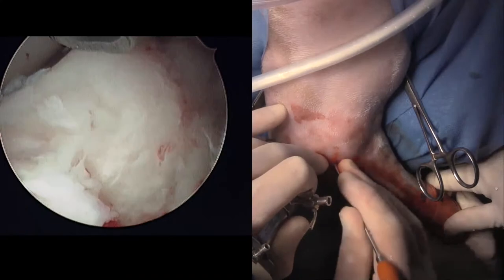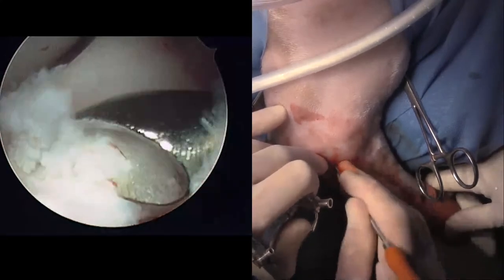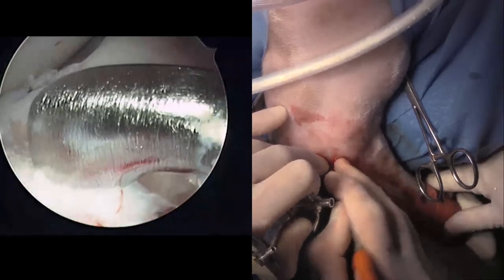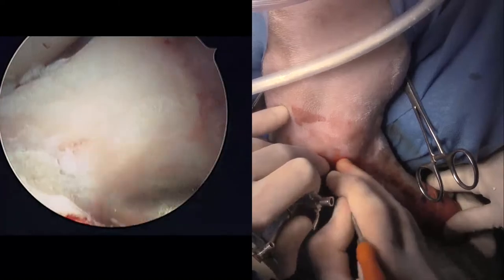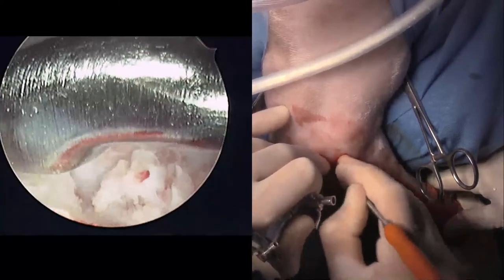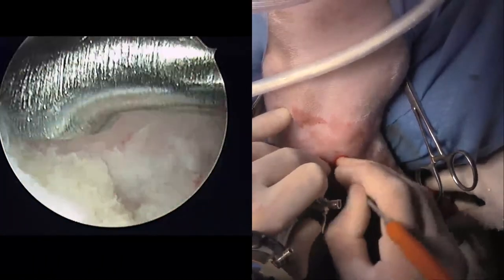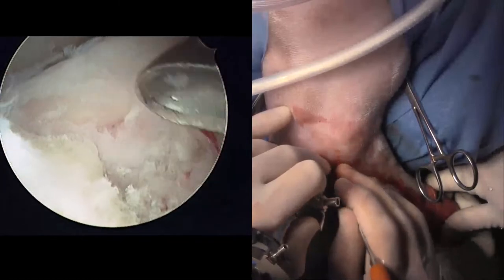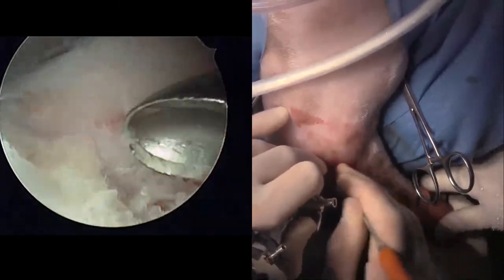I can find, there it is. So that's my curette. So I'm just now cleaning up that surface a little bit. Ideally, we should get it back to bleeding bone, but that is such a chronic lesion, so we might not be able to get that bleeding.